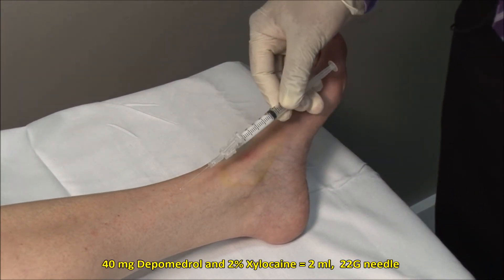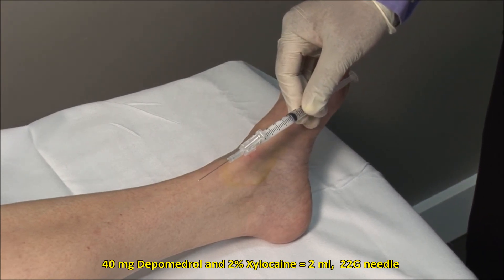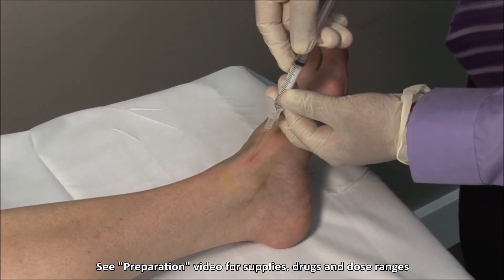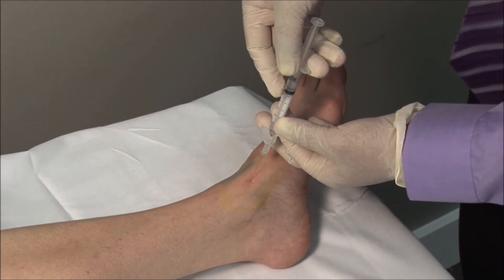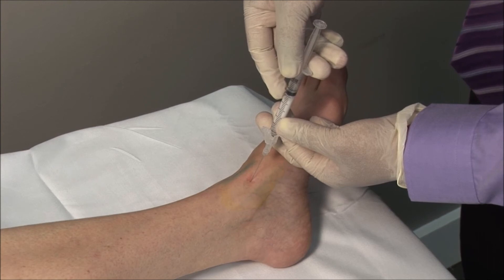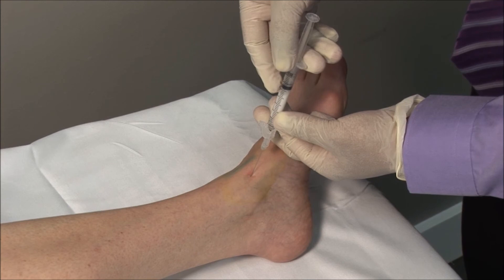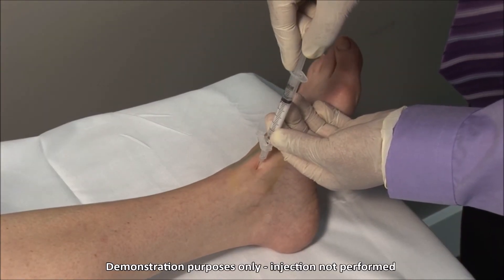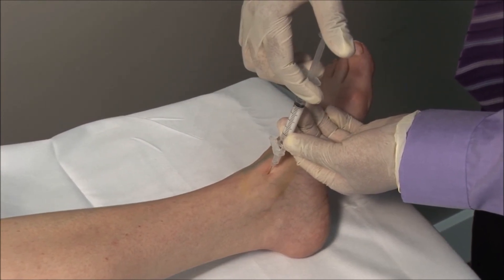Here I have a 22 gauge, one and a half inch needle and a mixture of 40 mg of depo-medrol with 2% xylocaine mixed to a volume of 2 mLs. Advance the needle through your mark, almost parallel to the foot and aiming posteriorly and laterally, and advance the needle to a depth of about 2 cm. Always aspirate to ensure that you are not in a blood vessel and then inject the solution. It should go in freely.